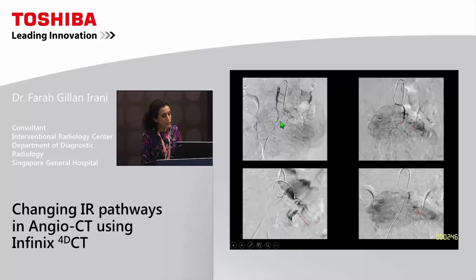And we can see that on this angio, it's really difficult to make out whether there is actually a bleed or not. So we went in from the SMA, went selectively down here. And you think, well, this is a bleed. There's a lot of bowel motion, you're not very sure. You go down a little further, but you still think that this is.